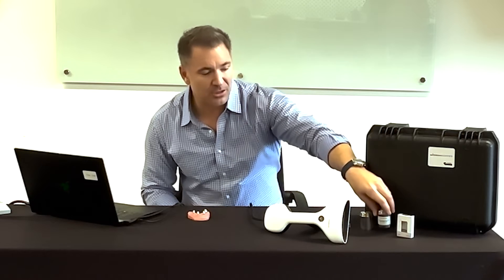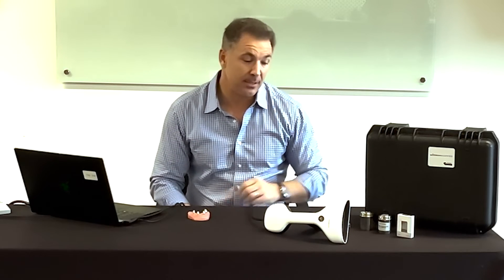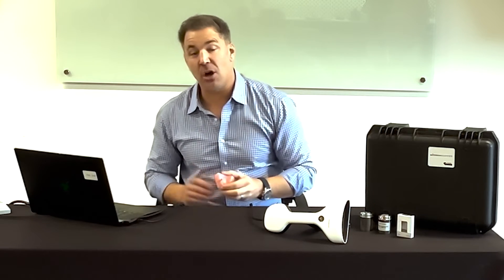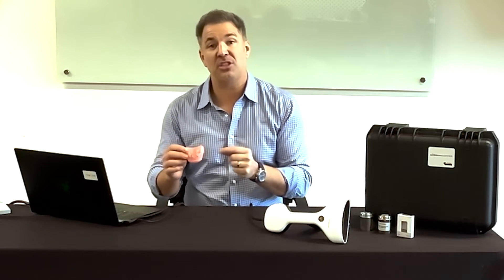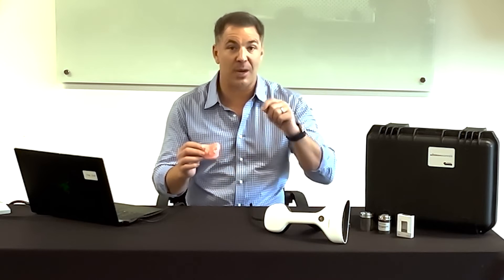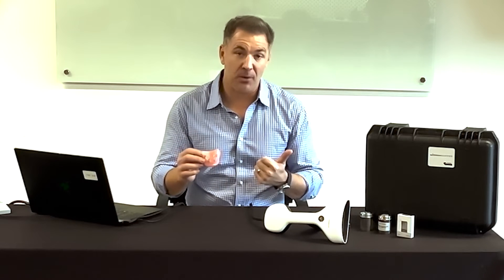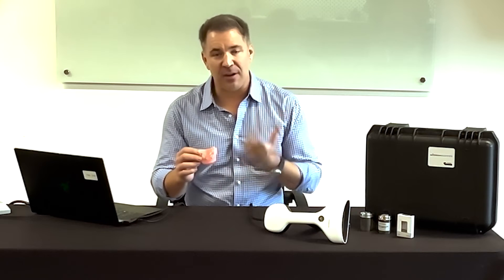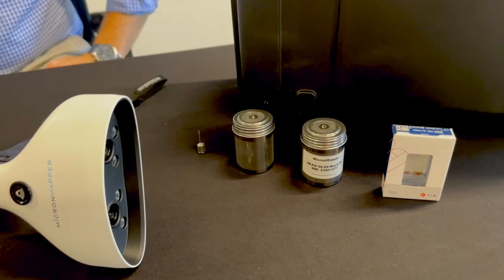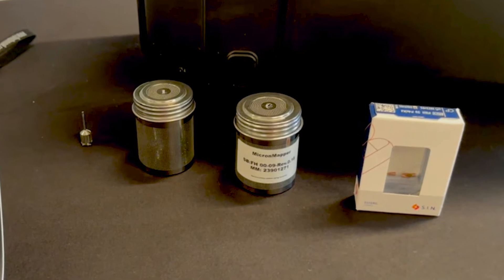One tin canister will come with a set of 10 scan bodies, and another will hold your drivers specifically for the scan body screws. The scan bodies use the PRH 30 screw, which is one of the more common screws on the market, compatible with multi-unit or temporaries on 3D prints — whether it's PMMA, zirconia, ti-base, or ti-bar substructure.